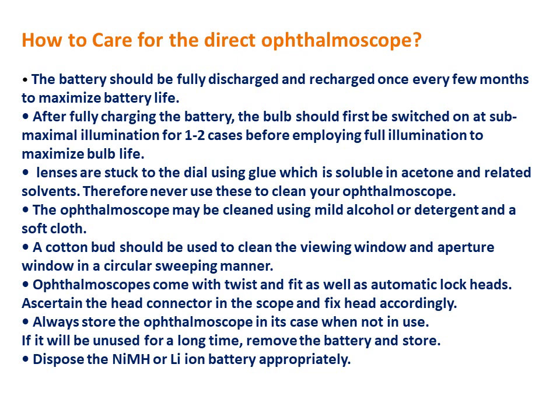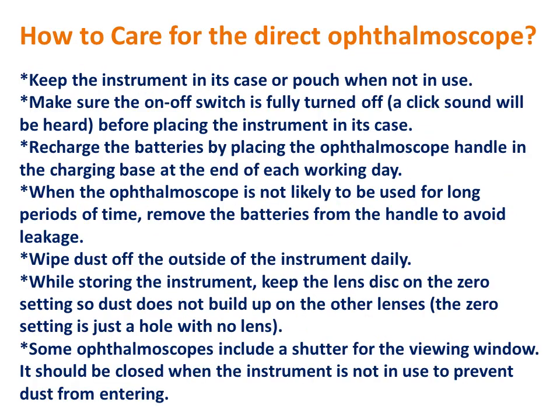If it is not going to be used for a long time, remove the battery and store the ophthalmoscope. Dispose of the batteries appropriately. Keep the instrument in its case or pouch when not in use. Make sure that the on-off switch is fully turned off. A click sound will be heard when you turn it off, before placing the equipment in its case.